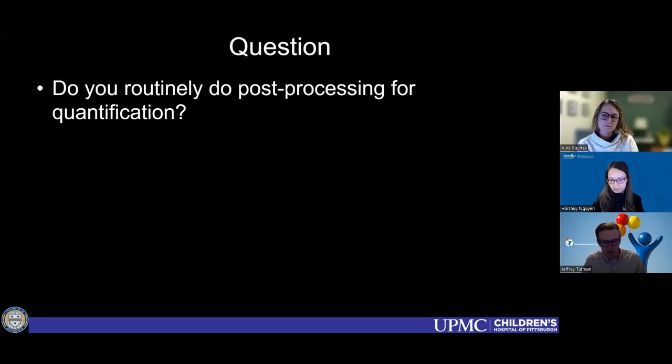Yeah, we are not. It's definitely an interesting concept, but it's not something that I have explored in Colorado yet. I'm really curious, is this automatically built into your machines? Is it a separate software package you have to buy, or how does the logistics of that actually work? So for us, it's part of the software package, the contrast software package.